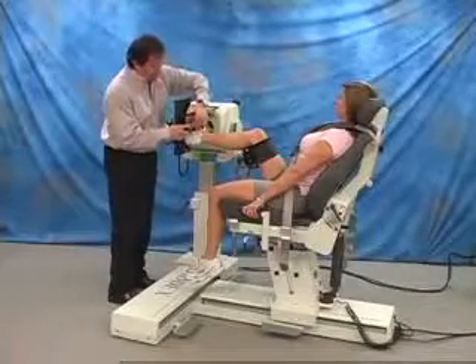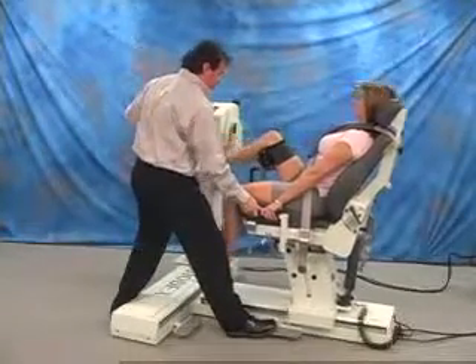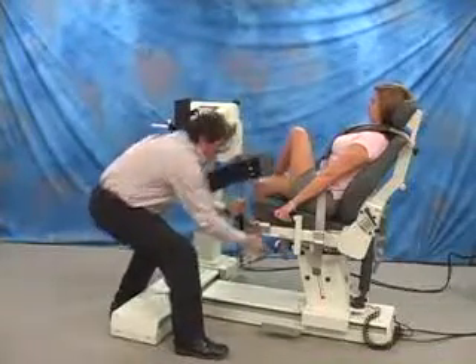For the opposite side, unstrap patient and move chair back. Move limb support to opposite receiving tube.